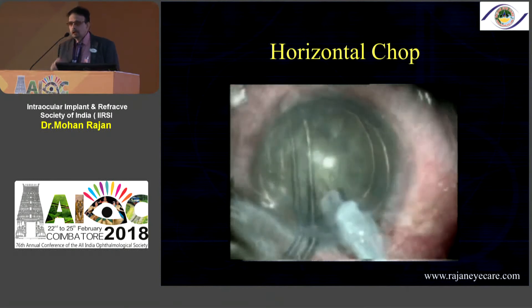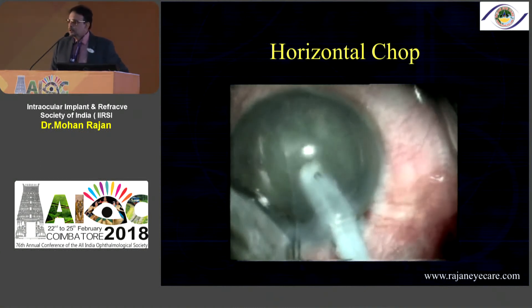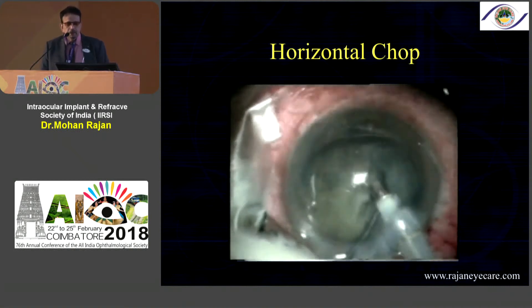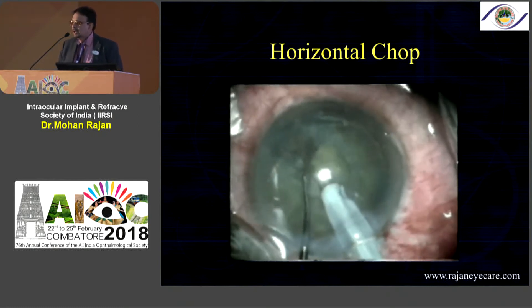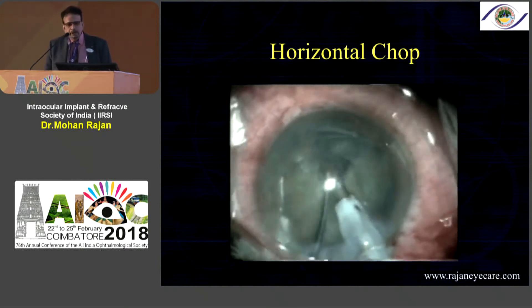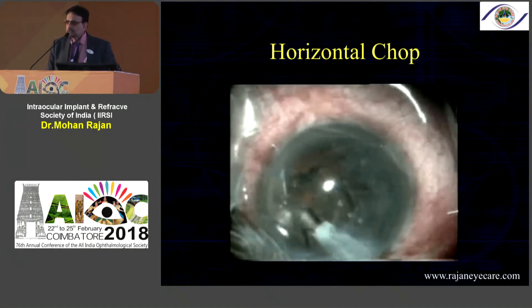This is a horizontal chop, which you can do for dense cataracts with a good cortical cushion. You go underneath the incision and come from the equator. You need to use a blunt chopper — don't use a sharp chopper because you can damage the zonules and the posterior capsule. What is important is to bury the phaco handpiece. In all chopping techniques you need to go a little vertically down and come from the periphery, that is from the equator. In brown cataracts there's a problem with horizontal chop because there is nucleus and more nucleus and very less cortex, which is why we cannot do this technique for brown cataracts.